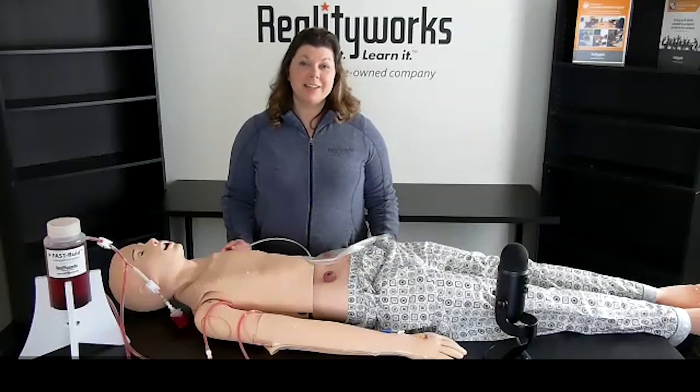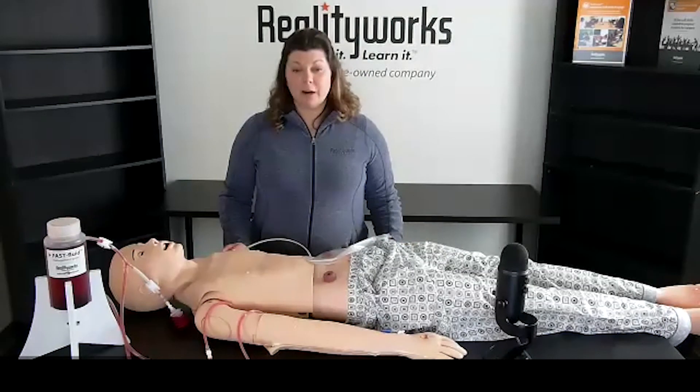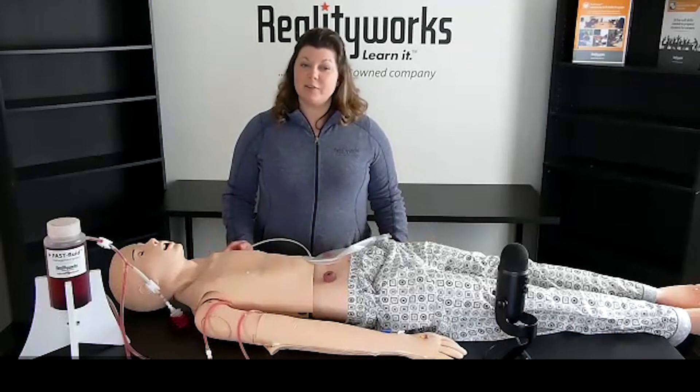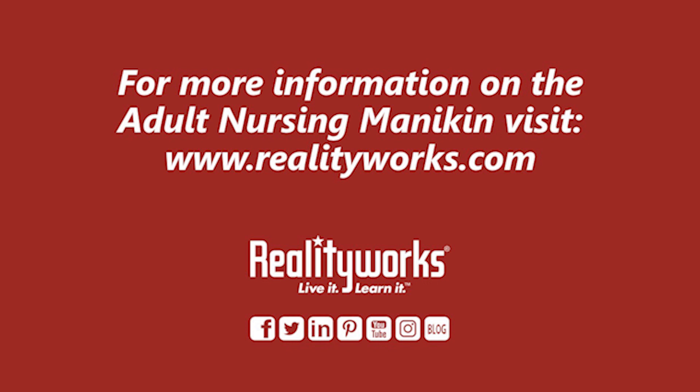One reason this mannequin stands out from others is that it is medium fidelity with over 20 different skills. It teaches a lot of basics at a great price, so you could have a couple in your class if needed. As you can see how this all fits together — you're using the lessons to teach foundational knowledge and then using that knowledge by practicing the skills on the mannequin. If you have any questions or would like to receive more information, please use the information on the screen and we'd be happy to help you.